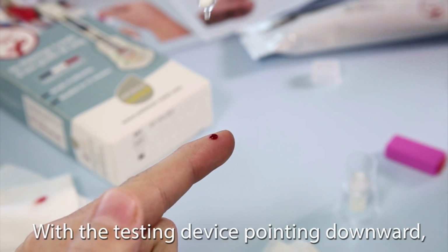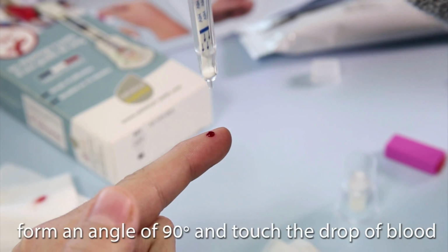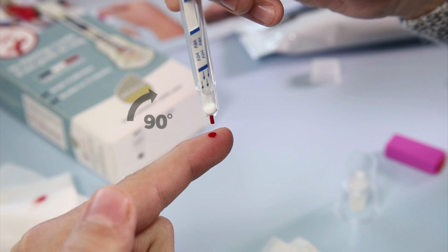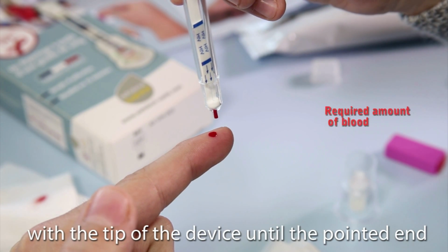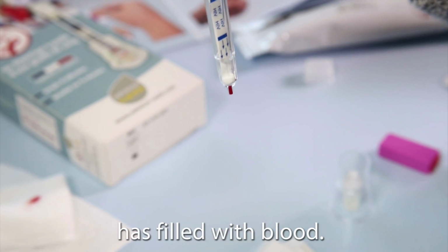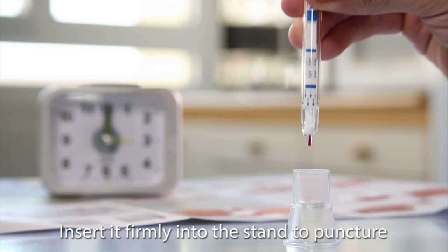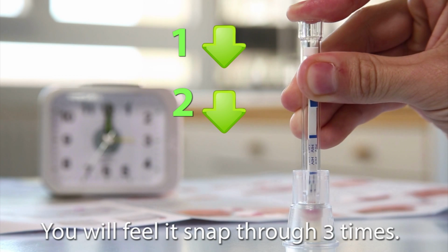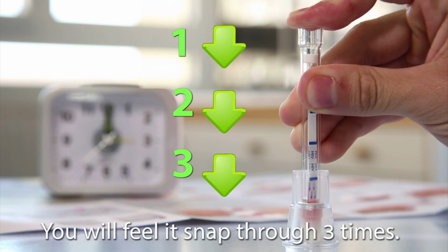With the testing device pointing downward, form an angle of 90 degrees and touch the drop of blood with the tip of the device until the pointed end has filled with blood. Insert it firmly into the stand to puncture the foil cover of the buffer cap. You will feel it snap through 3 times.